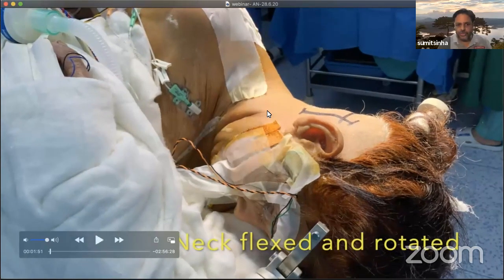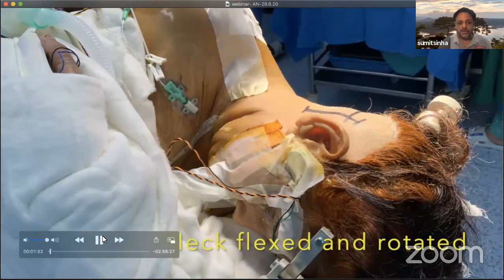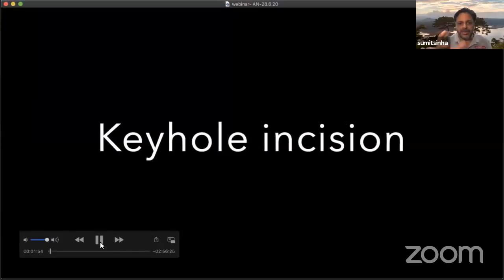Okay, so let's move forward. You can see that this is the flexion of the neck. You have to really fight with the anesthetist to achieve that amount of flexion. This is really important to achieve during the surgery in the positioning, for the reasons I already mentioned. And you see that the neck is slightly rotated.